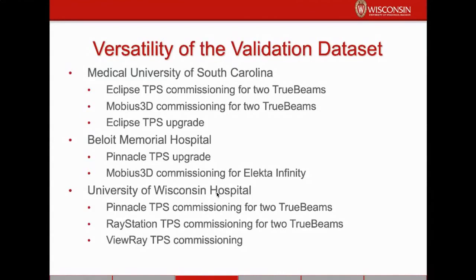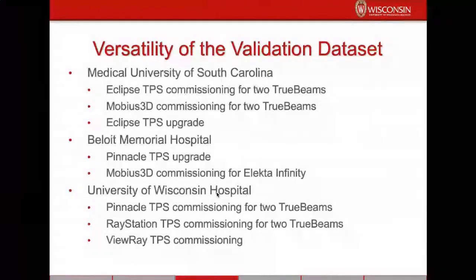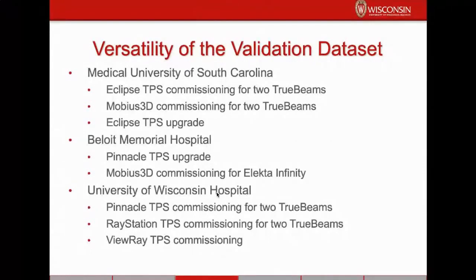One of the nice things was that we didn't have to make any additional measurements to perform this validation. We had the validation data from commissioning the treatment units. And so we just used the same data and calculated plans using a new algorithm and did the same dose comparisons that we did when we first commissioned Eclipse. And we were able to assess Mobius 3D without doing a lot of extra work, which is really valuable.